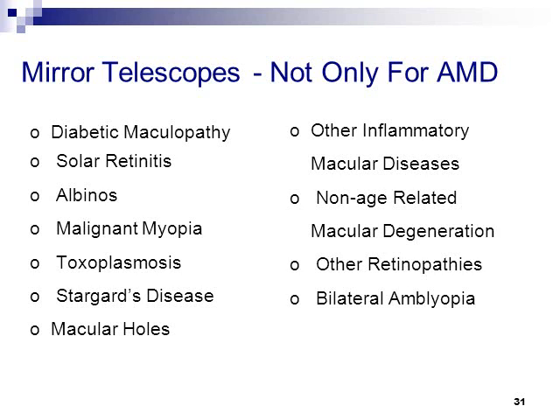An important target group is the group of patients who suffer from albinism. These patients need only mild magnification, approximately 60 to 80%. That can bring them from around plus or minus 20/60 to 20/40 so that they can drive and function better. Malignant myopia is another interesting group, and even patients with diabetic maculopathy, if a retina that was treated before is currently stable, can be treated.